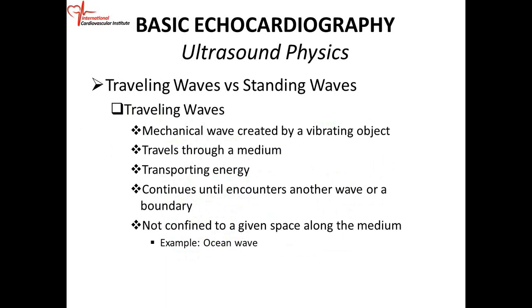Now we're going to move on to something a little bit different. We're going to look at what we call traveling waves and standing waves. We commonly talk about harmonics, as opposed to the fundamental frequency, the harmonic frequency, or the second harmonics. Most of our ultrasound is done using the second harmonics, as opposed to using the fundamental frequency. So the images are a bit crisper, but objects look a little bit thicker.